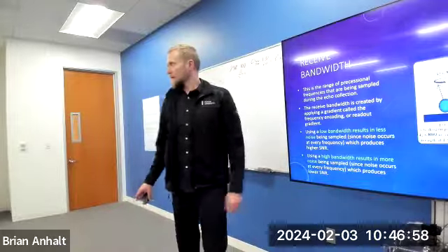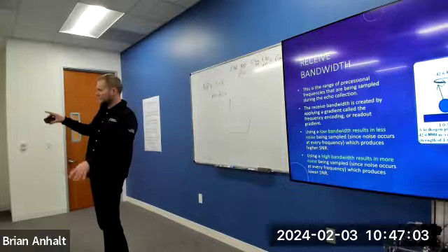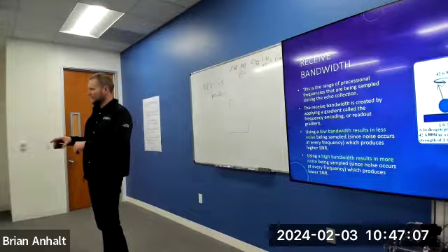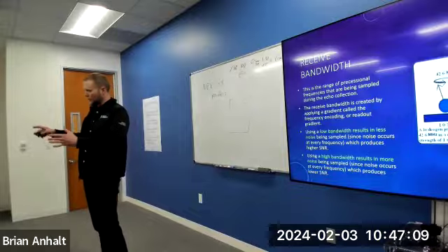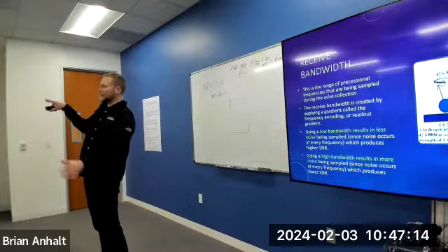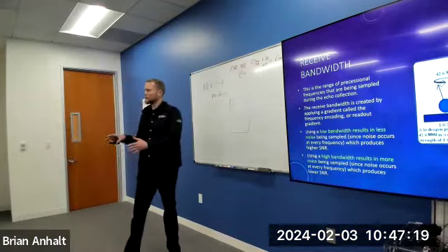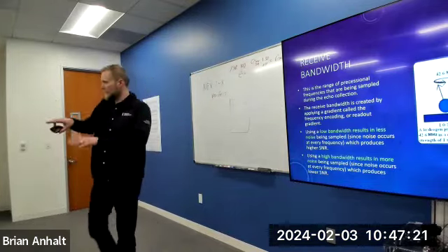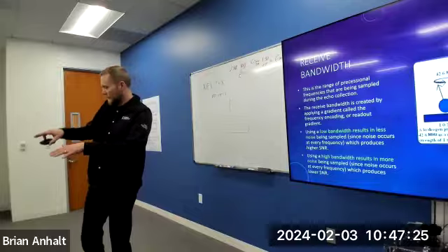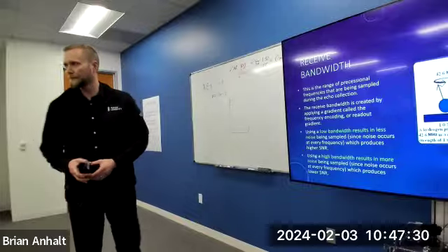Turn on the gradient to create a range of frequencies across the field of view, across whatever we just excited. A larger, or higher, bandwidth is going to be created by a steeper gradient, creating a larger range of frequencies across the distance. Lower bandwidth is going to cause that gradient to be shallower. Or better said, the shallower gradient is going to cause a lower bandwidth of frequencies across the field of view.